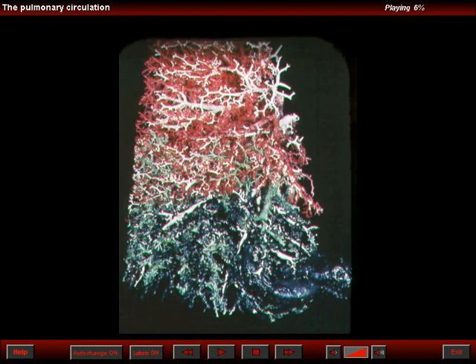A cast corrosion preparation showed that this patient had a systemic arterial supply to the right lower lobe without bronchopulmonary sequestration, and the tracheobronchial tree appeared absolutely normal. So this is an unusual example of systemic arterial supply to the lung without the bronchopulmonary sequestration. And in this case, the so-called scimitar-like finding is due not to an abnormally draining vein, but to large arteries that come off the distal descending aorta, proximal abdominal aorta, celiac trunk, or right phrenic artery.